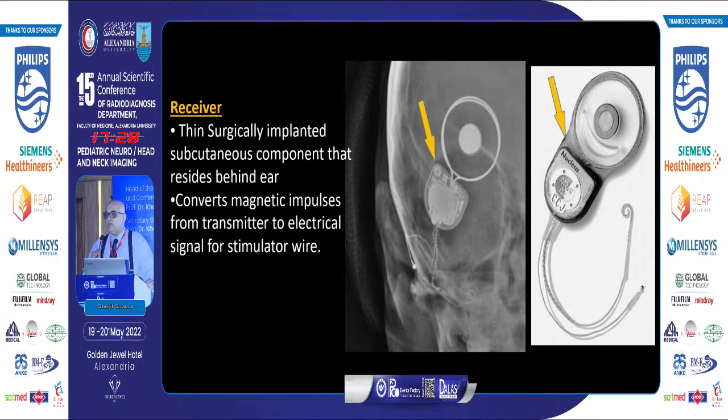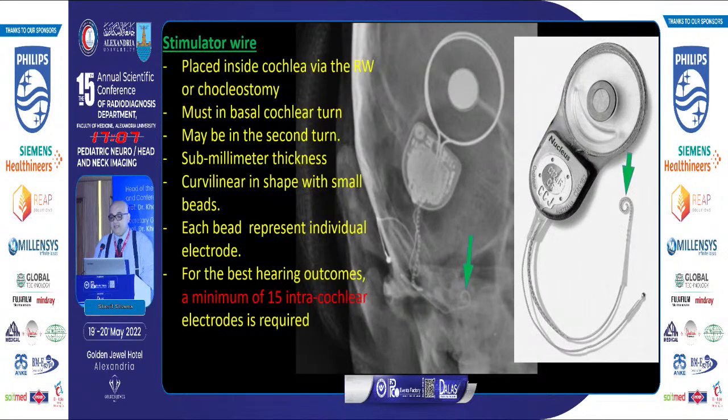Our radiological target is the receiver. The receiver takes a characteristic shape and is implanted subcutaneously behind the ear. It converts magnetic impulses received from the transmitter to electrical signals sent to the stimulator wire. The stimulator wire is placed inside the cochlea through the round window or through a dedicated ostium — the cochleostomy.